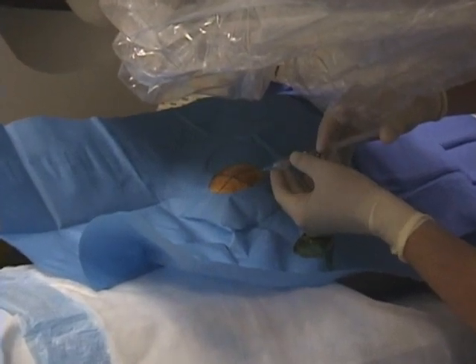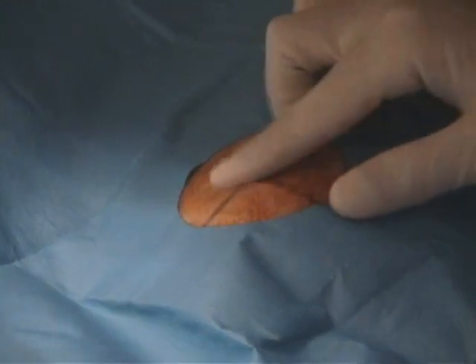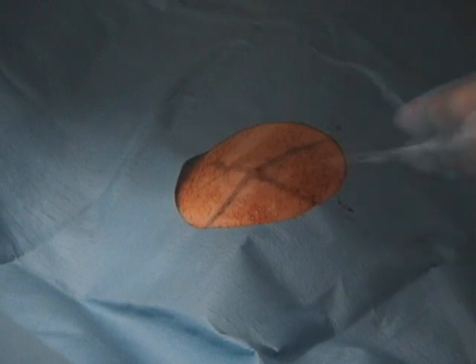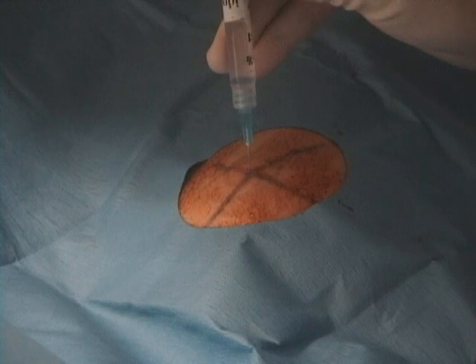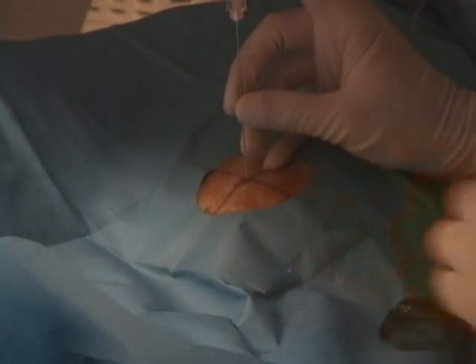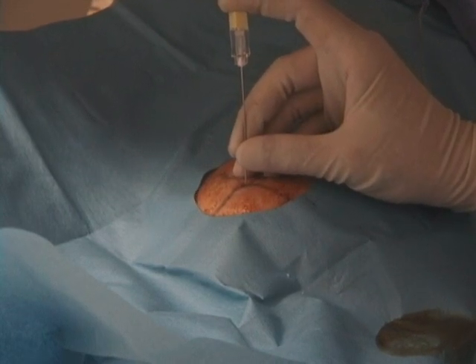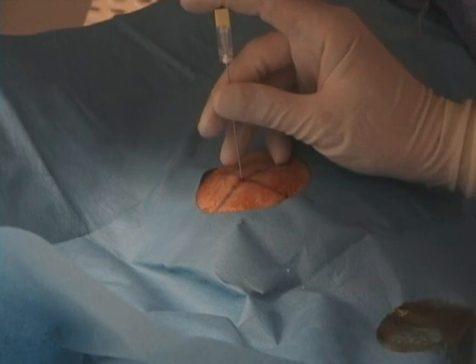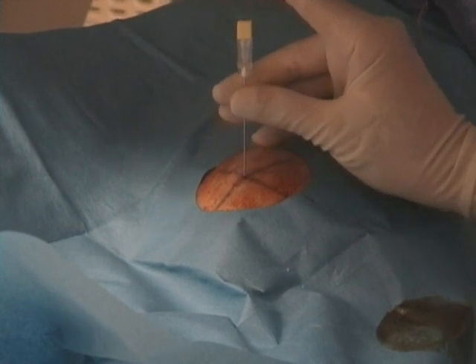Give the patient about two or three cc's of lidocaine. First give a small amount directly underneath the skin, and then follow that up with a deeper lidocaine. Then you can put in the spinal needle about two centimeters and then check your position under fluoroscopy. After adjusting the trajectory based on the fluoroscopic images, you can go ahead and advance the needle.